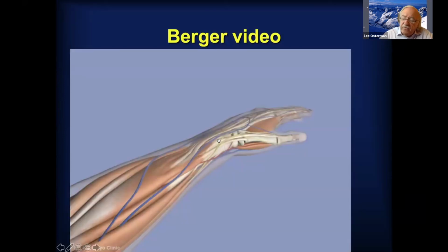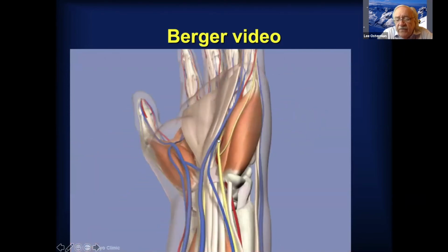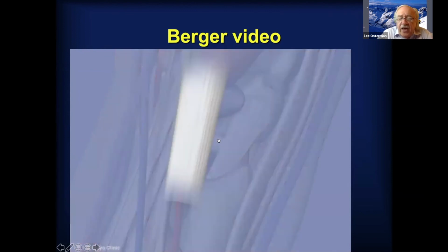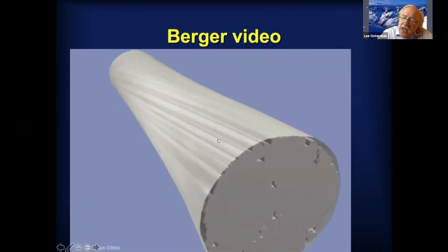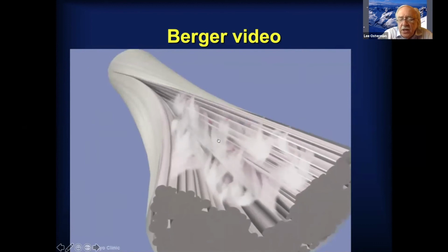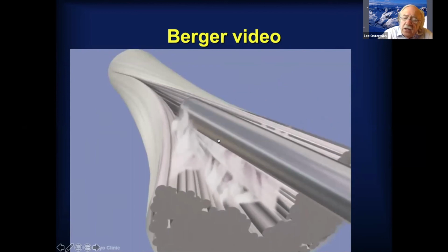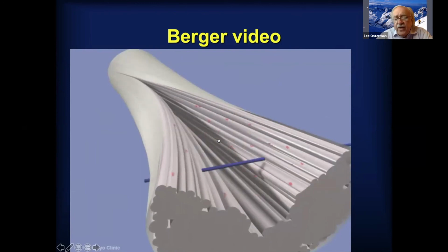Dick Berger gave a wonderful video, which he shared with me, which, see if it'll play, which I think just puts it in your mind, so that you have a torque injury to the wrist. As it torques, these fibers separate, and you get this defect between the ulnar extrinsic ligaments. It does try and heal, and so sometimes it's not quite as obvious, but this tear extends from the prestyloid recess. So once you make the diagnosis, you debride that as you do. And then you're going to simply put cross stitches across that, and that will then reef that for you.